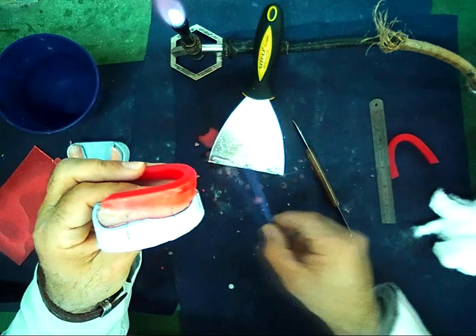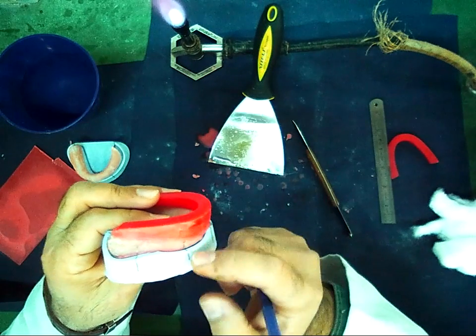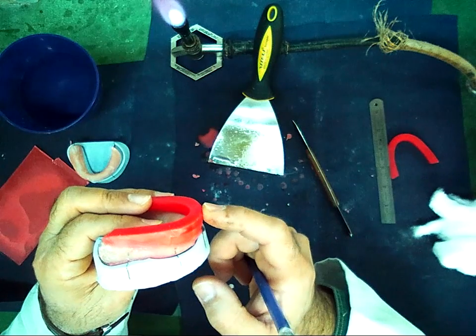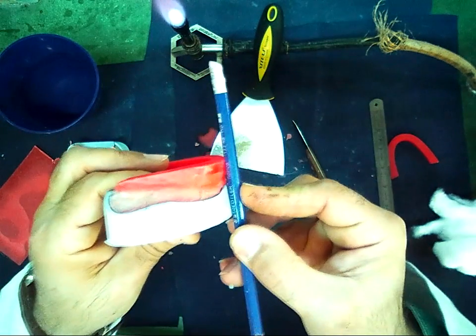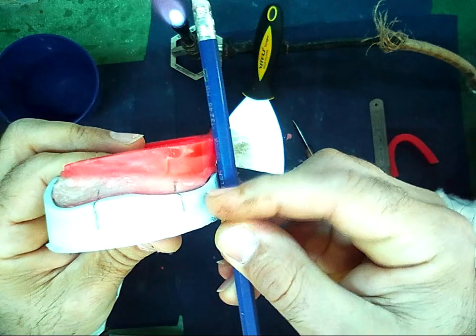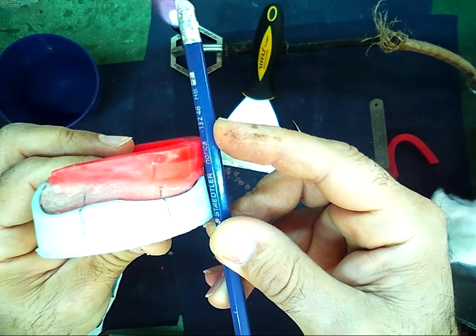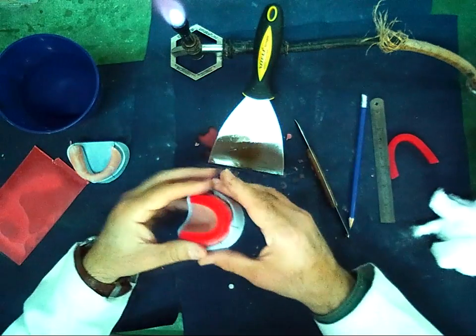If there is any space between the pen and the cast, then this inclination is more than 2 mm. As we see, there is a little space between the pen and this part and the cast. So I should remove a part of the inclination.